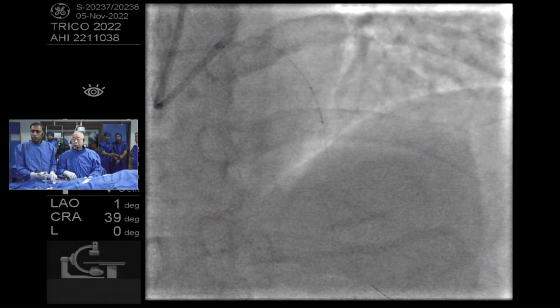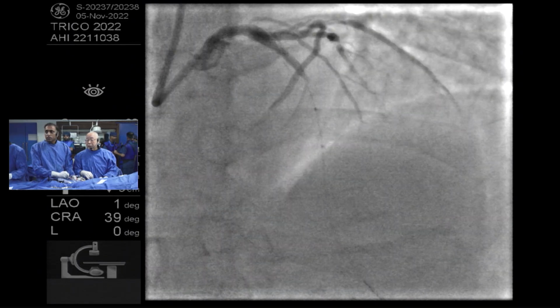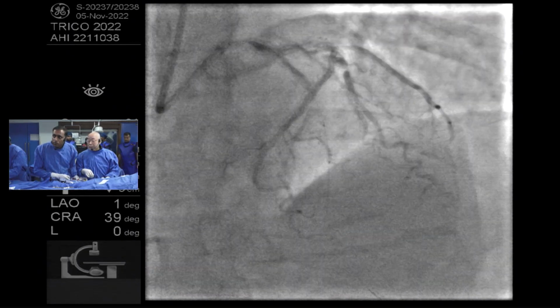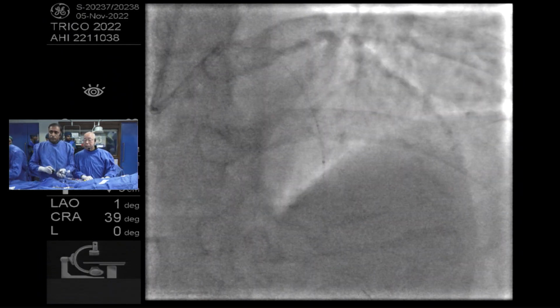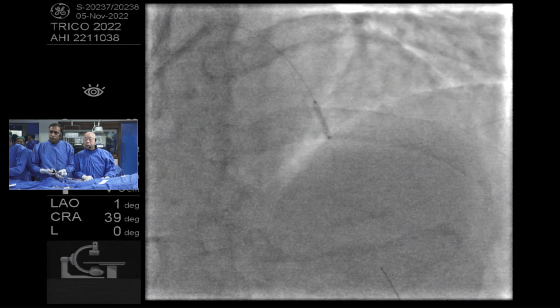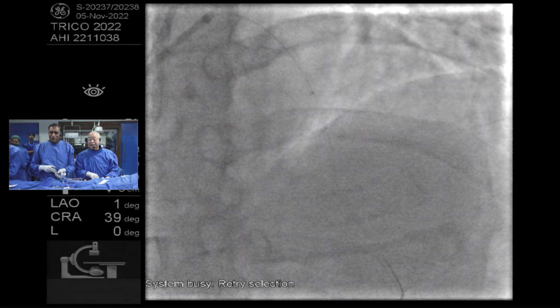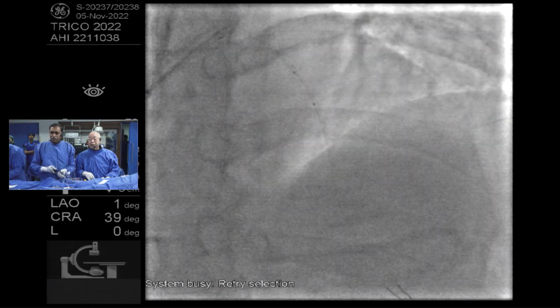This is fine. Okay, just cine. Going up.